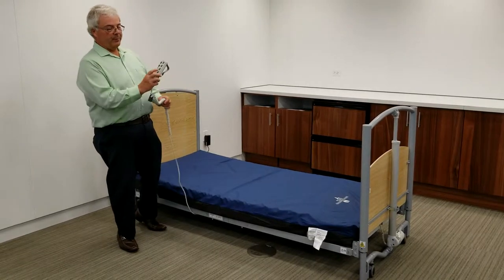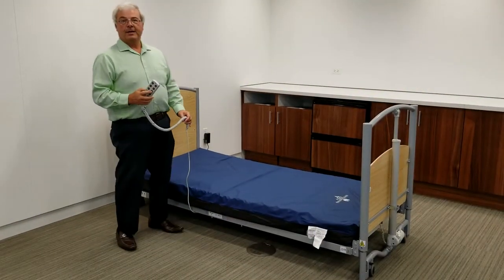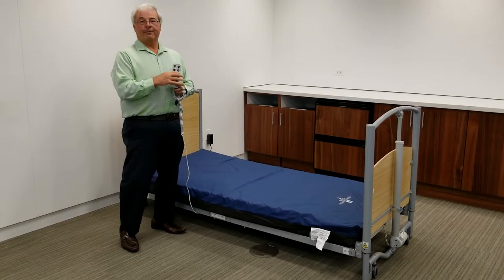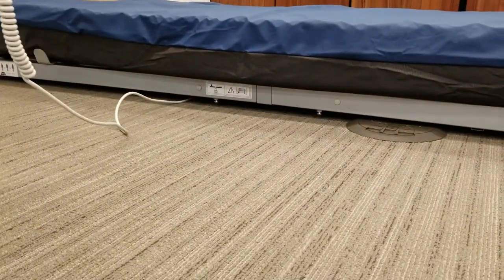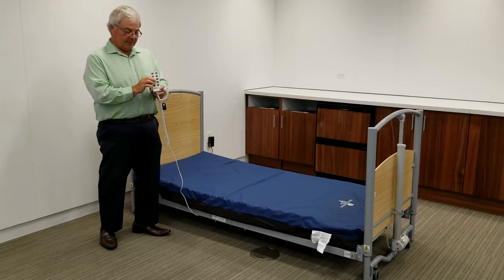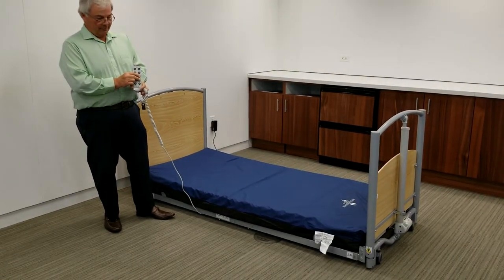Bring the bed down. When you bring the bed down with the handset, it will stop at a normal low bed position — in this case, eight inches. You need to make a clinical decision to make it go to the floor bed position, which is where you'll put the patient when they're unattended in the room or at nighttime. To do that, you've got to hit these two buttons simultaneously as described in the handset. When you do so, the bed will go down to its floor bed position, where the deck height would be two and three-quarter inches off the ground.